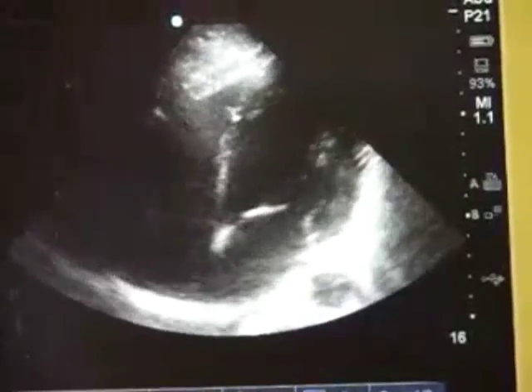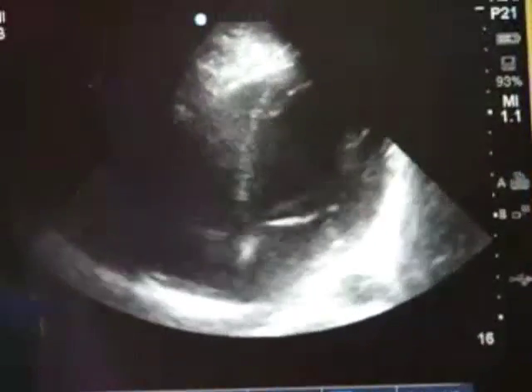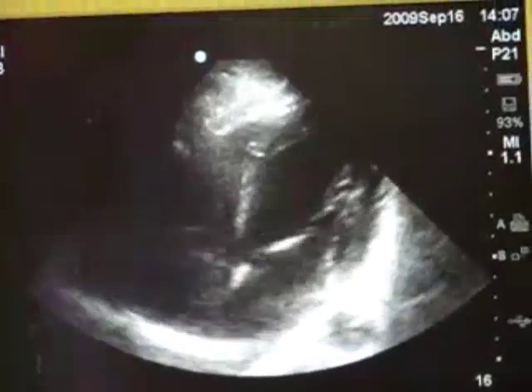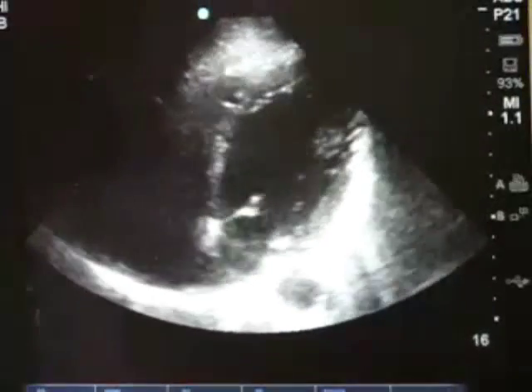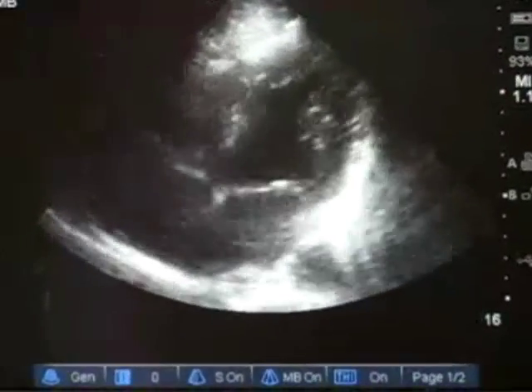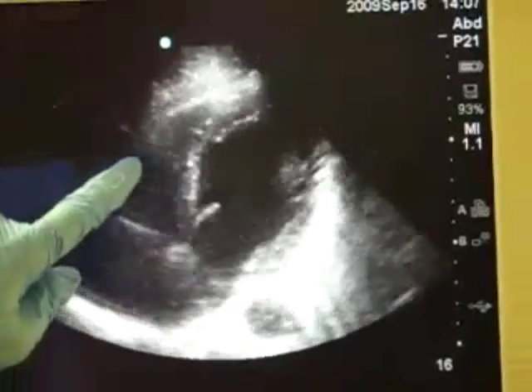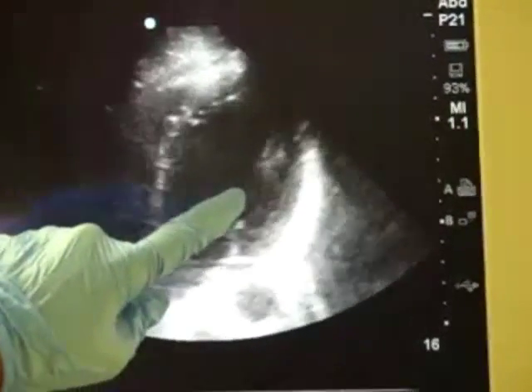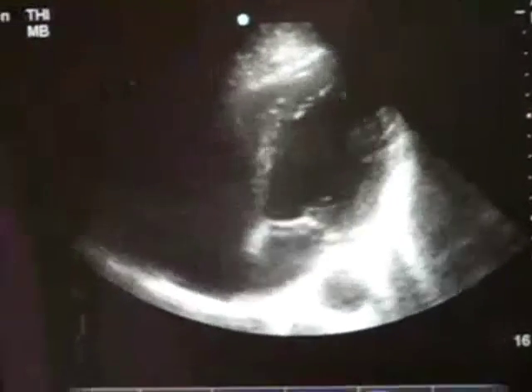This is the most challenging of the images to obtain, but can be of significant use when trying to assess the size of the right ventricle. For example, in a case of a physiologically significant pulmonary embolism, where the right ventricle can be larger than the left ventricle. Please note, however, that a small pulmonary embolism cannot be ruled out using this method.